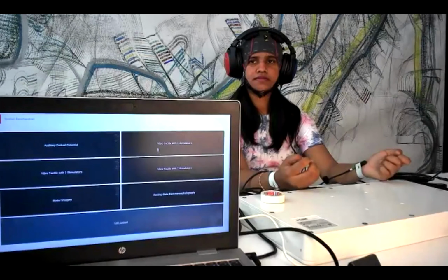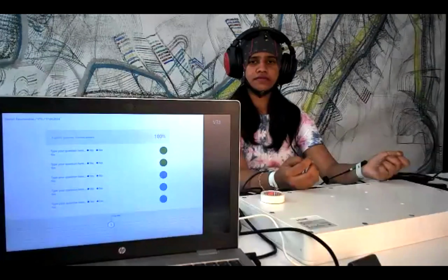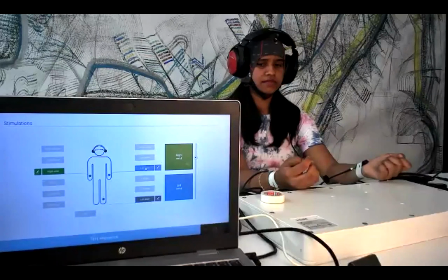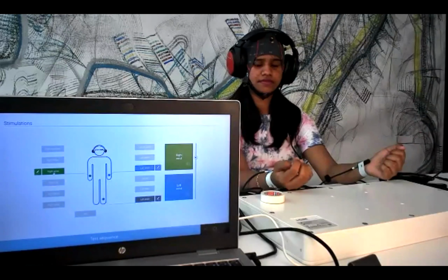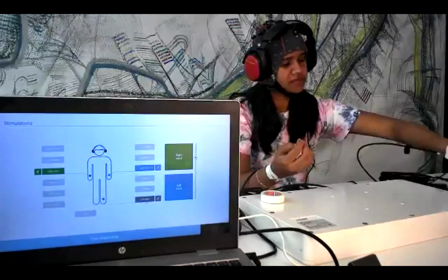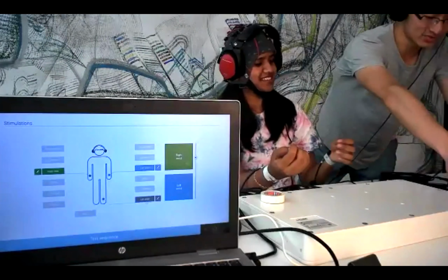So since we still have a little bit of time, I will also try the VT3 paradigm. In this paradigm, we will add additional distractors. So now we have, again, the left and right. Let's try again if this is left or it is switched. Is this left? No, it's still left. Okay. Here is right. Okay, perfect. And then I add an additional one for the ankle. So I will move to the other side. Okay, thank you.